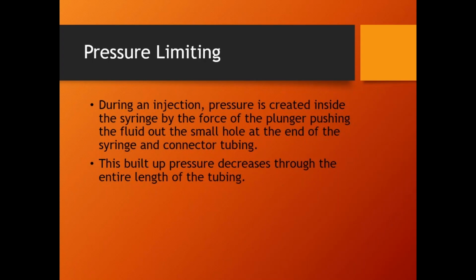I want a volume of 50 milliliters, but I'm just saying don't exceed 300 psi. If we don't get to 300 psi, the injection is not a failure. The pressure limit is just a safety precaution. Say don't exceed this. We might only get 20, 50, 70 psi. That's fine. Just don't go over 300.